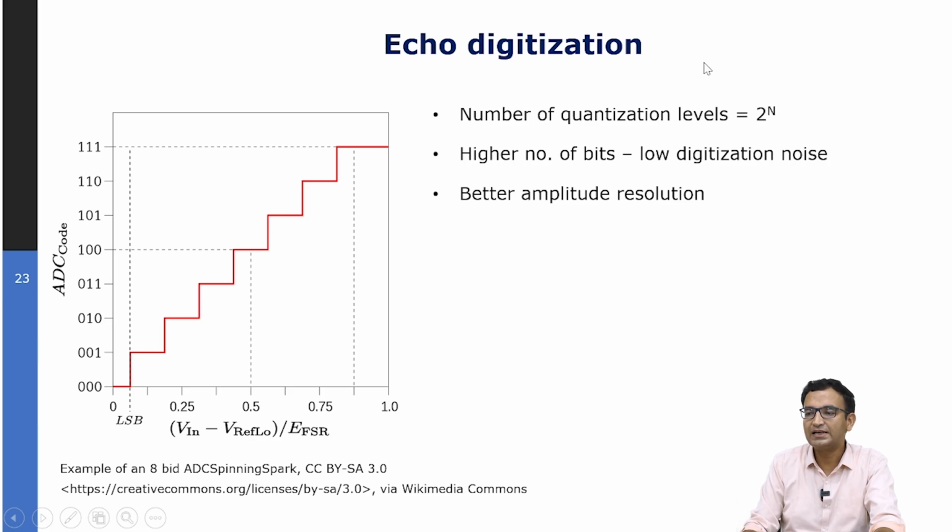Next, let's discuss the digitization step. So far, in brief, we are discussing some of the steps required in getting the ultrasound image information. And this is a very brief discussion. We are only scratching the surface. But nonetheless, I believe this will be a starting point for you to get into in-depth study of these topics.